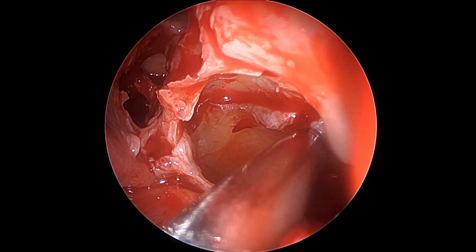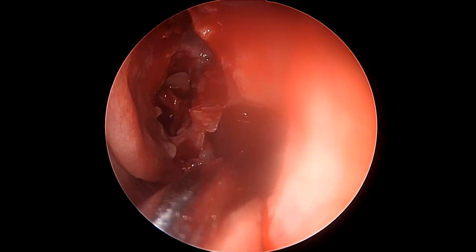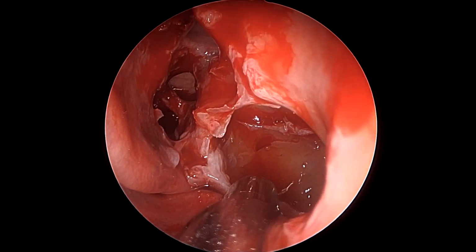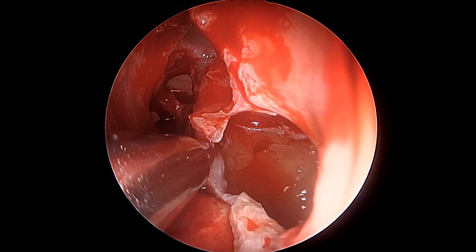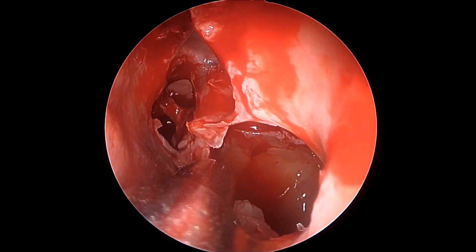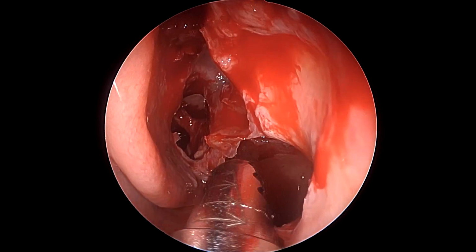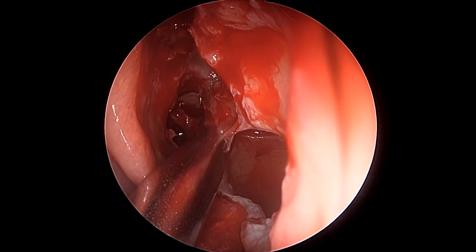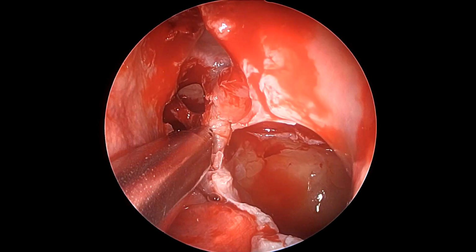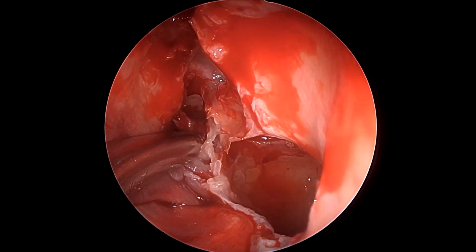Now, due to the deviated septum, which shall be dealt with later using the septoplasty, we can resort to an angled microdebrider blade, normally a 40-degree one, to give us a good trajectory of surgery to widen the access to the maxillary antrum, enlarge the antrostomy, and also to clear the ethmoid complex and the frontal sinus. It is particularly useful in instances of some deviated nasal septum if that is not to be dealt with during the same surgery for some reason, but normally it is recommended that we do.